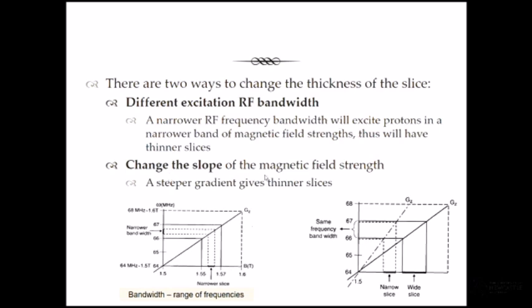And we can change the slope of the gradient, so we can make the gradient stronger. Remember I said there's a limit to how strong we can make that gradient before we start to have bioeffects. So the patients start to experience peripheral nerve stimulation. Photoscintillations: people that get imaged at 7 Tesla are in the scanner, eyes closed, and they've got flashing lights in their eyes because we're interacting with the conductive pathway to their optic nerve and their visual centres. So obviously we can't make that too strong, or we can give them permanent side effects.